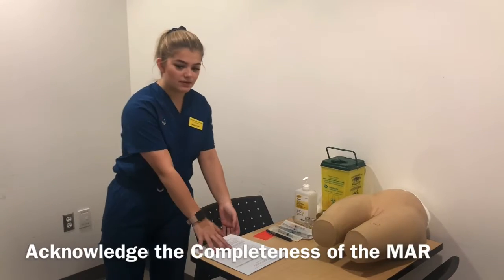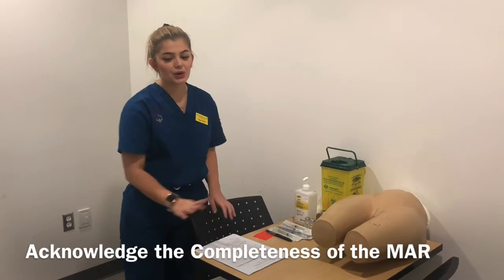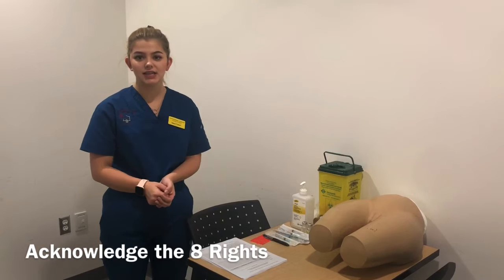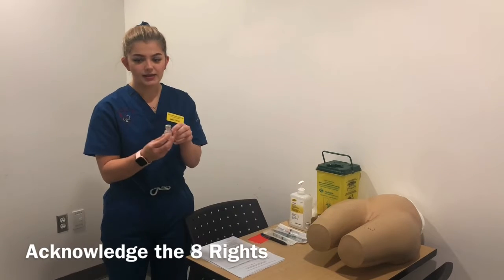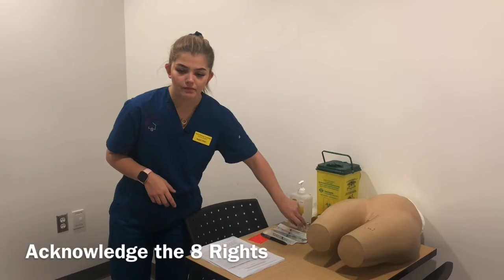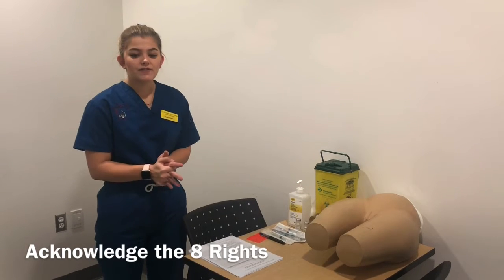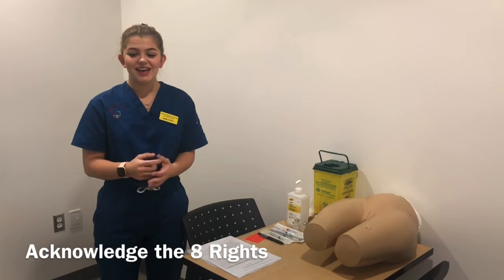So to begin, you want to confirm that your orders are correct and appropriate for your MAR and that they're going to match your MAR correctly. So going through the 8 rights, you're going to look at the MAR for the right patient. In this case scenario, it's Mary Mancini is the name on the order. I'm going to look at the medication label, and I'm going to ensure it's the right medication, right dose, and right route was pulled. So in this case, Mary Mancini dictates to give 5,000 units of heparin subcutaneously every 12 hours and to give 1 milligram of Haldol intramuscularly every 4 hours as needed.